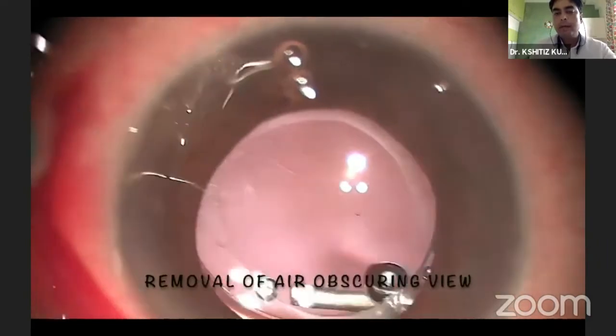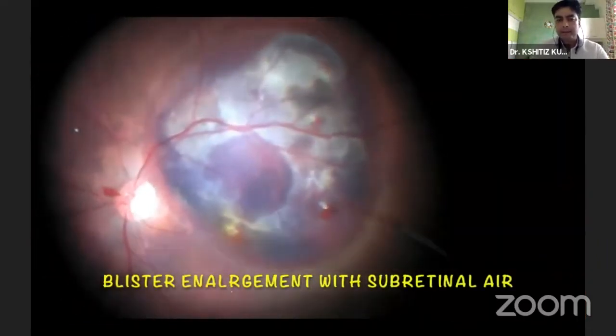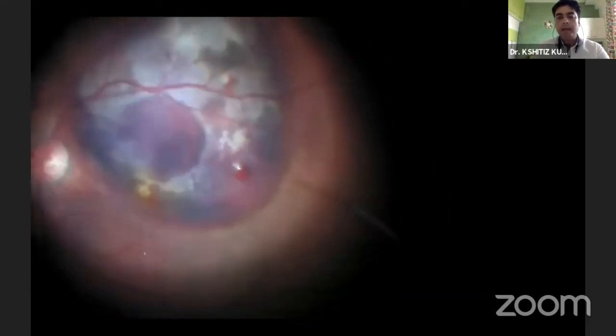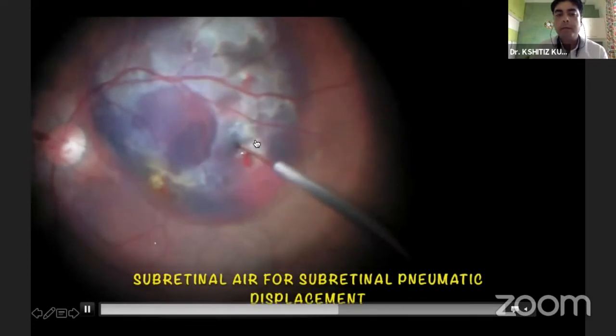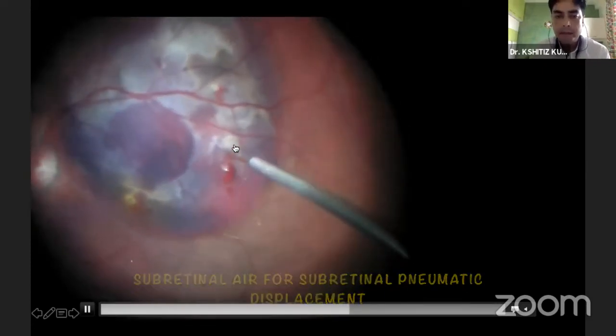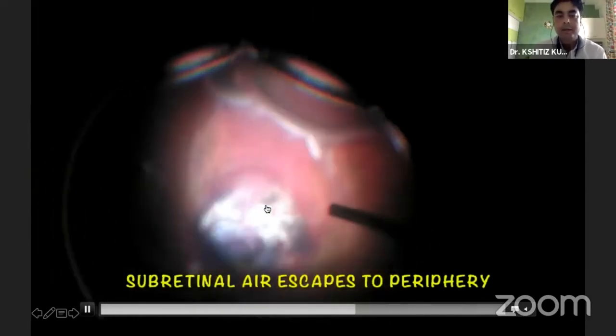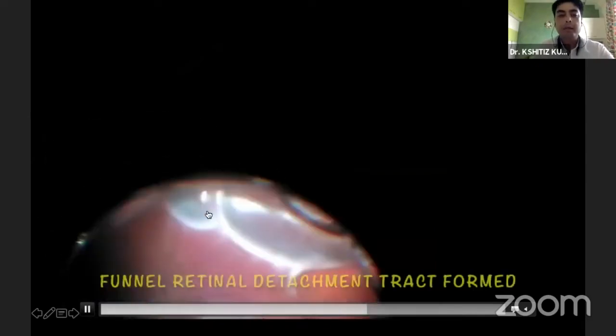At this point, the air escaped out instead of going into the subretinal space, though the blister had enlarged. So I came back again and tried, and now we can see that a fairly good amount of blister had formed. The final part was to achieve subretinal air. But the air escaped outside as well as towards the periphery, causing a localized detachment.